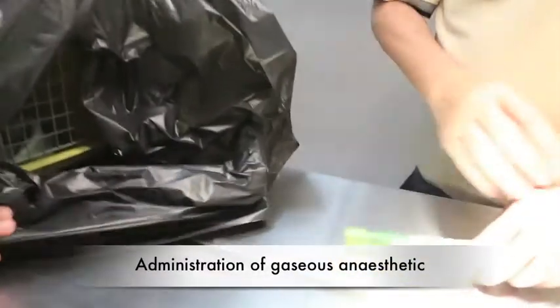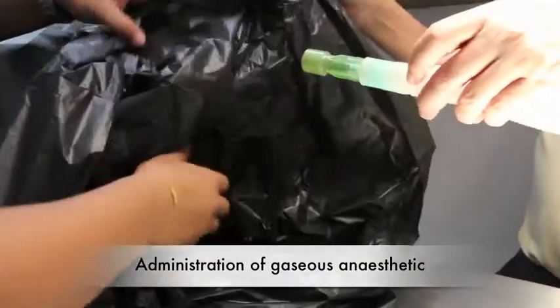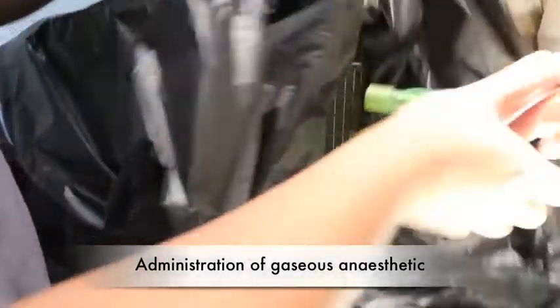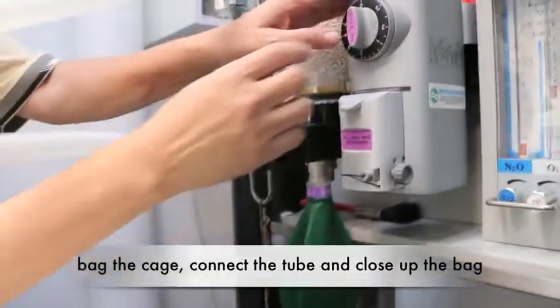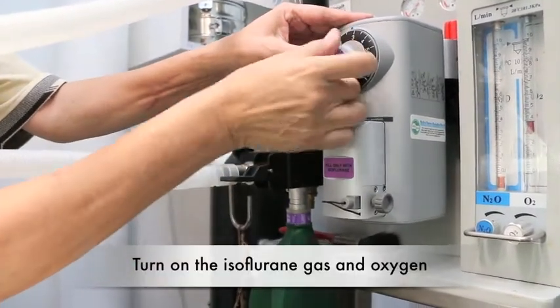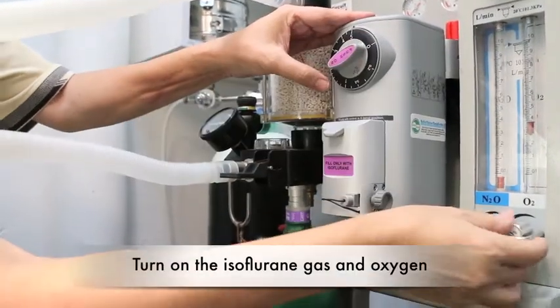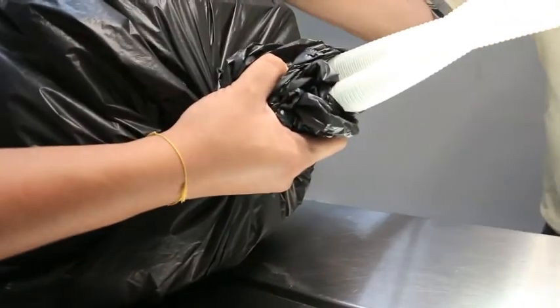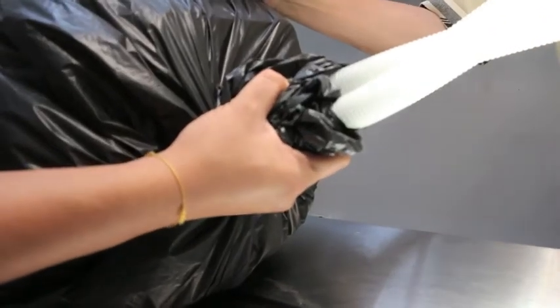Ready... no, so just to connect to the... we'll close up the black. This is another method. So we'll switch on the isoflurane gas for oxygen, 5% flow, and this method, the gas will go in to anesthetize the cat.